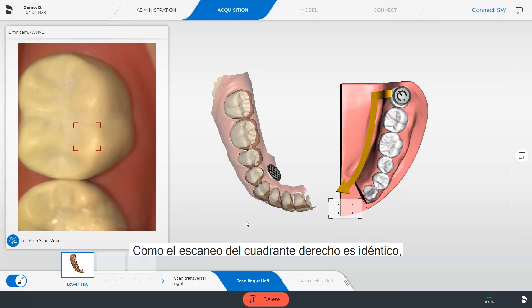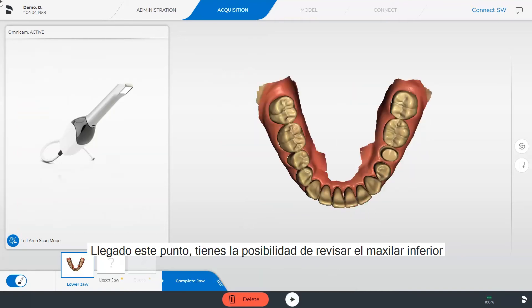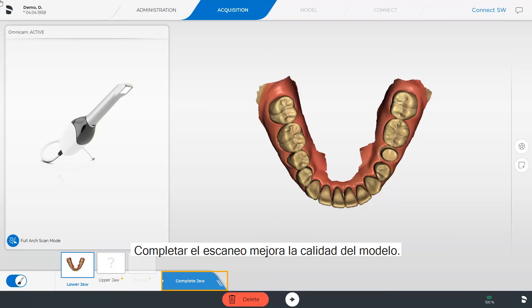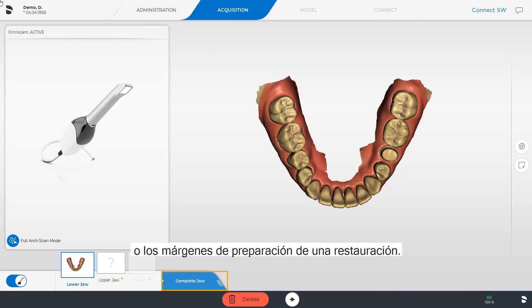Since the scan of the right quadrant is identical, we will look at the full scanned lower jaw next. At this point, you have the opportunity to check the lower jaw and complete it if necessary. Completing the scan improves the model quality. It could involve important areas such as proximal surfaces or preparation margins of a restoration.